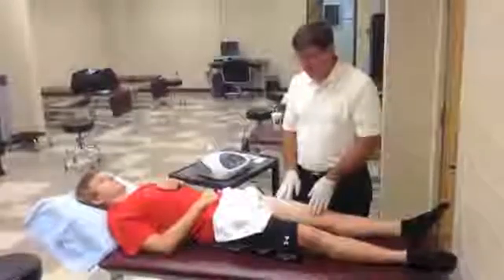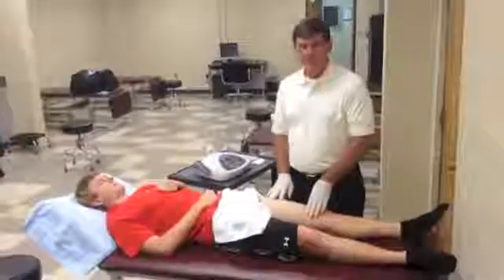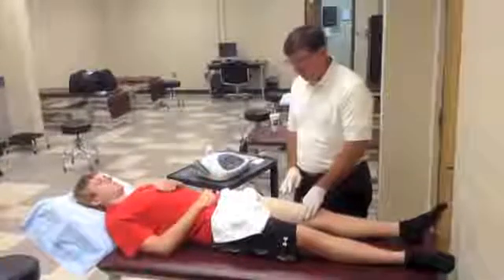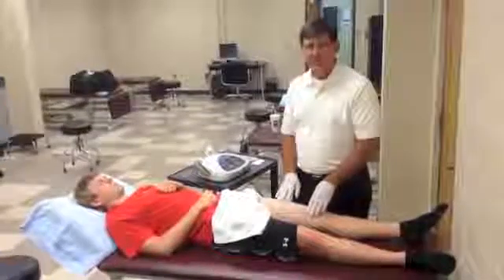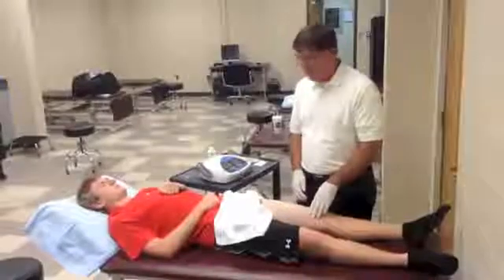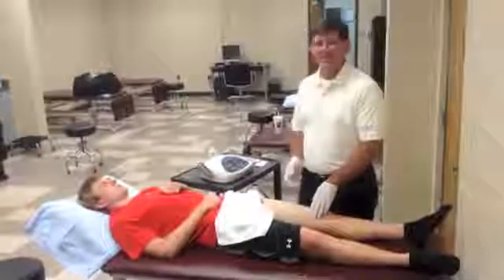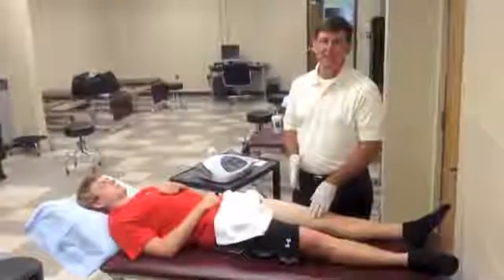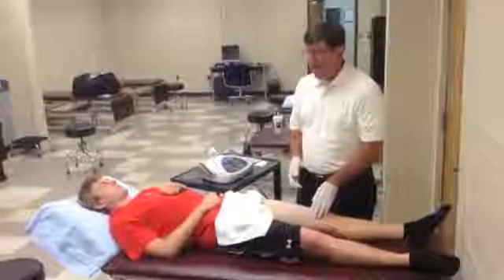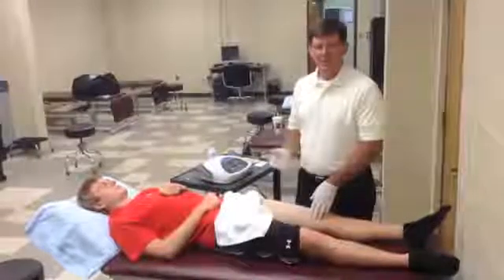Our patient today has a subacute quadriceps strain. It's got a little bit of puffiness and certainly some tenderness in the quadriceps. We're going to use the deep tissue oscillation to treat this, and it is very much a manual type of technique, but it includes electrical stimulation.